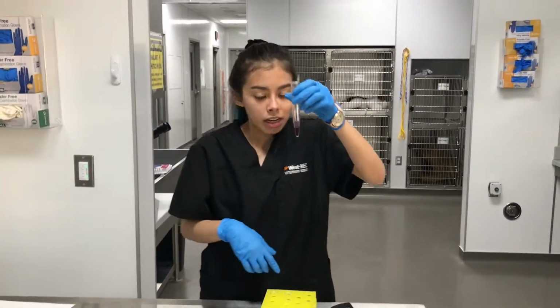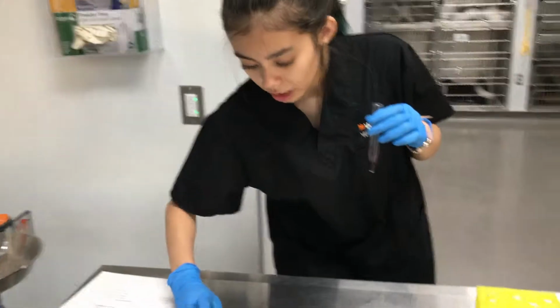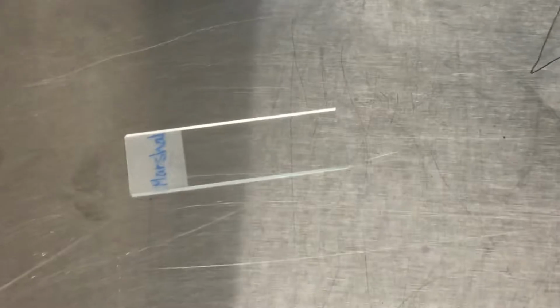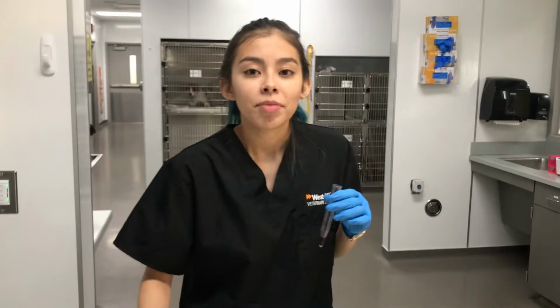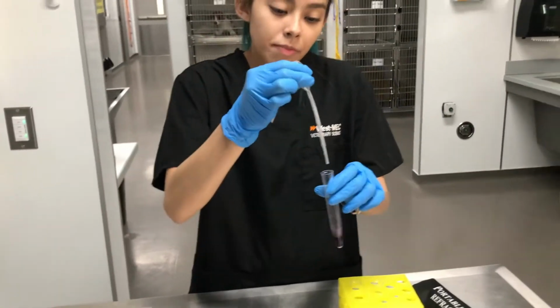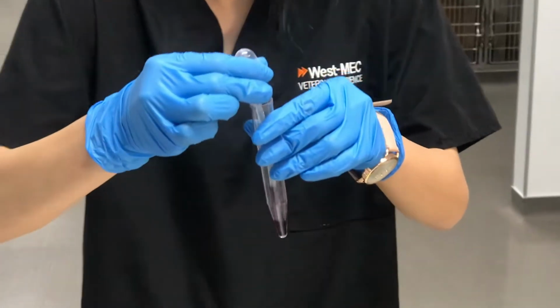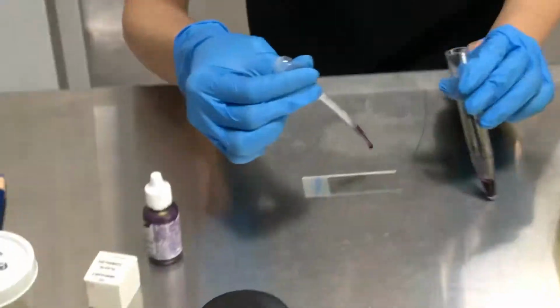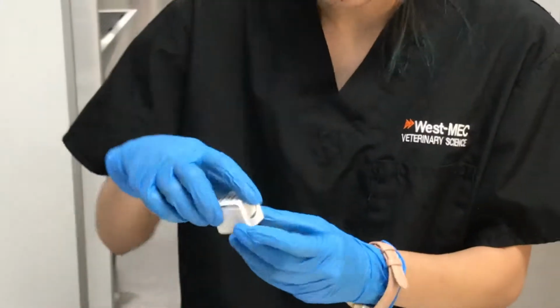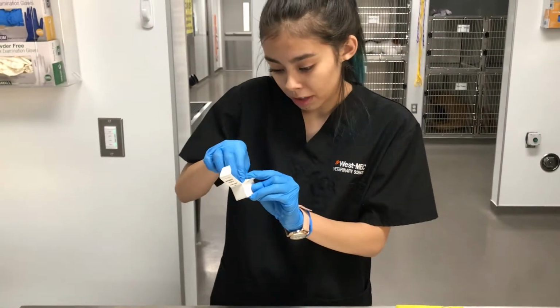And once that's mixed and done, I will add a drop of it onto this microscope slide, and before doing that, I'll have to have the patient's name on it, so when the vet tech is examining it, she can know whose this urine sample is. So using my pipette, I will grab the urine sample and add a drop of it. And I will dispose of this. And then I will grab my plastic cover slip and I will put it on top of this stain.